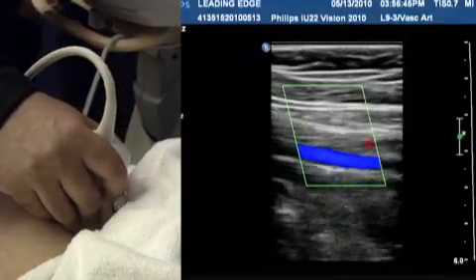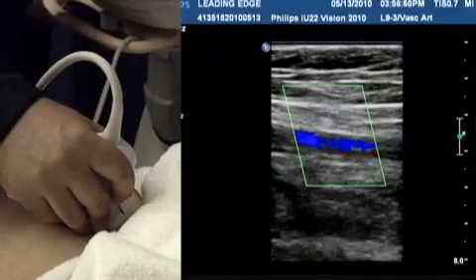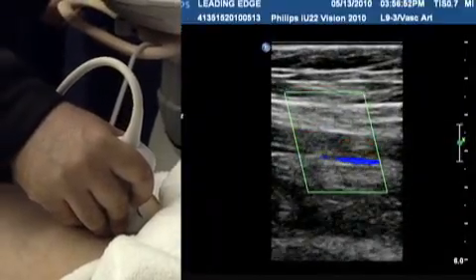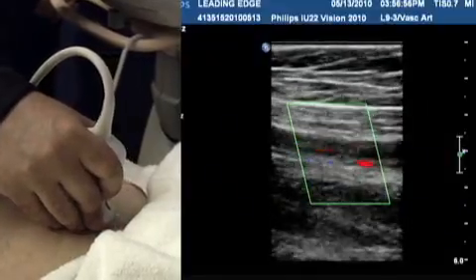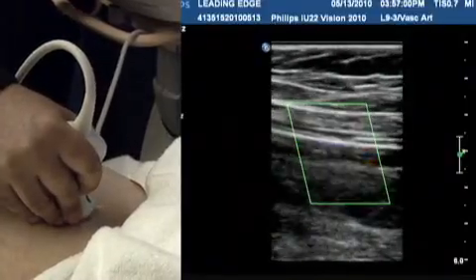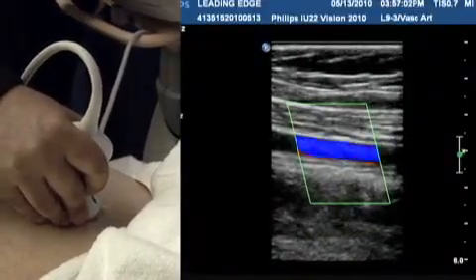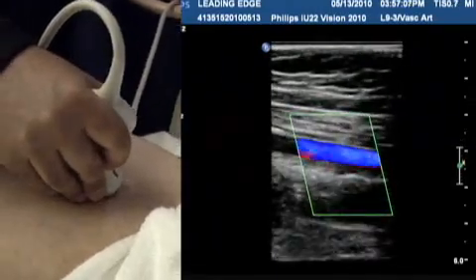And I think this is a huge time saver because the color flow image will give me a good idea about whether or not there is any significant disease along the length of the SFA, in terms of occlusion and stenosis. And in the absence of color flow changes that would make me suspicious, I just scan along the entire length of the leg.